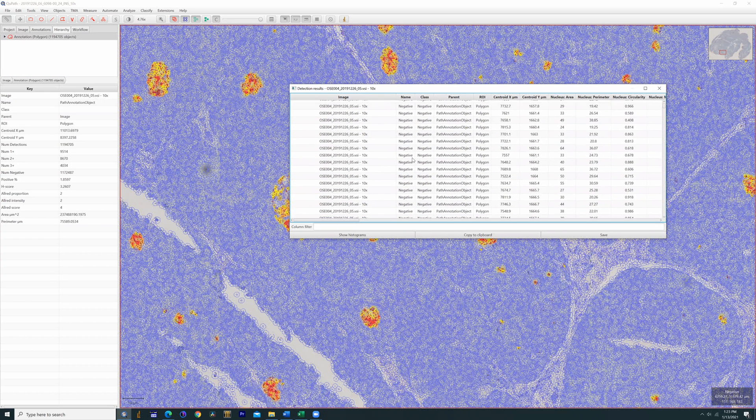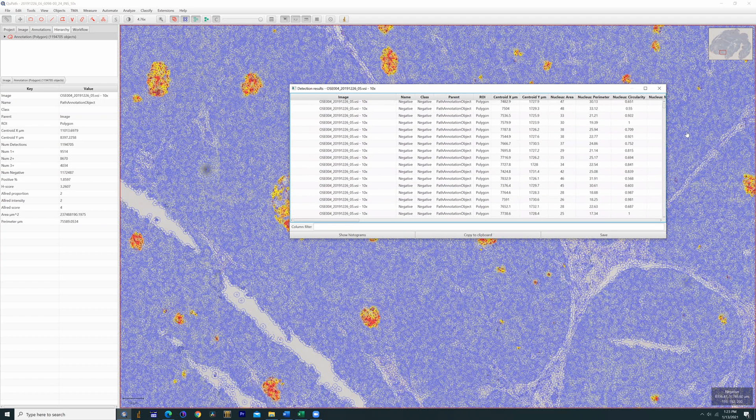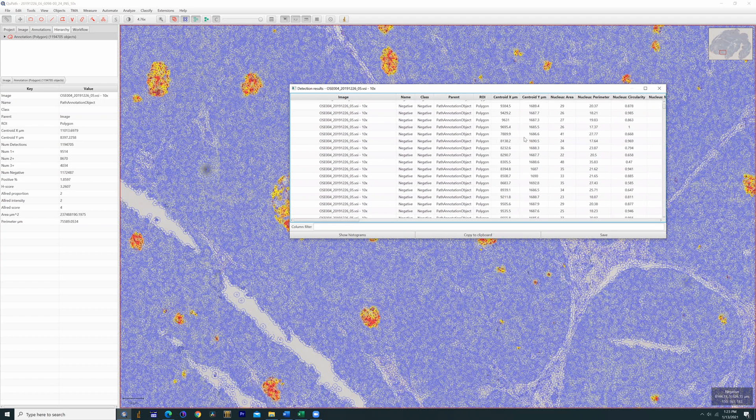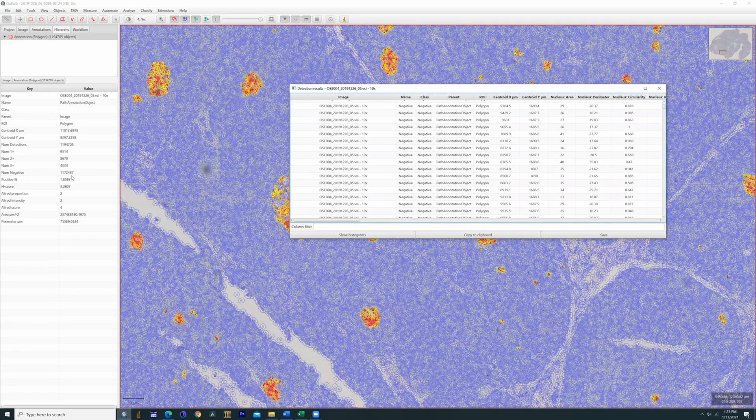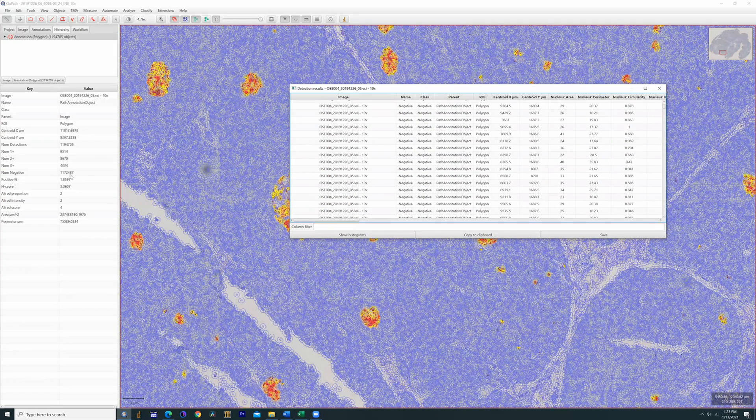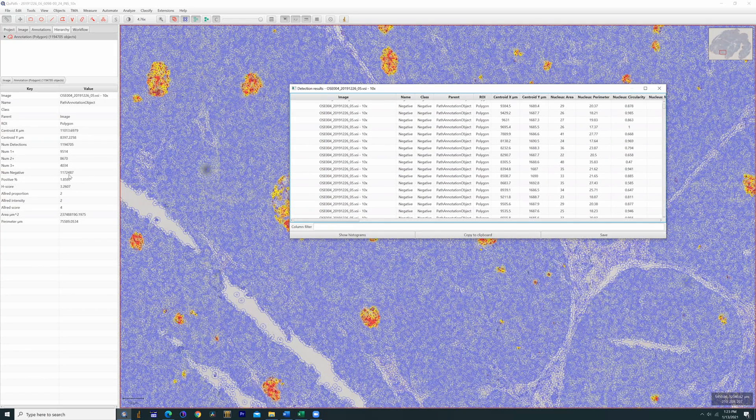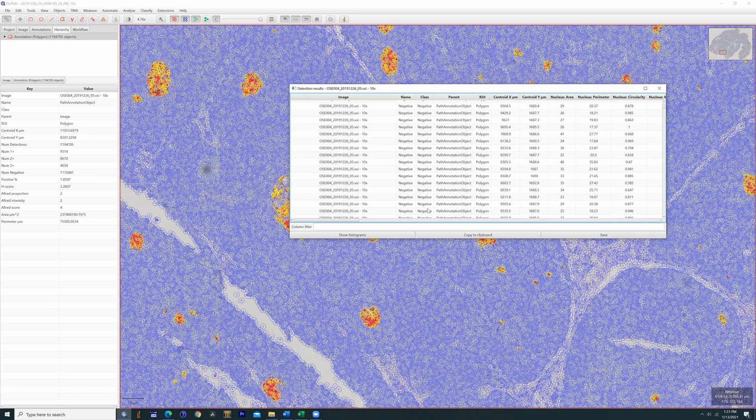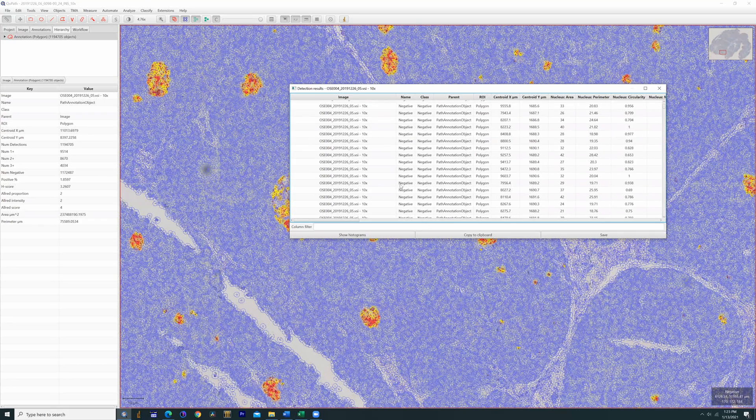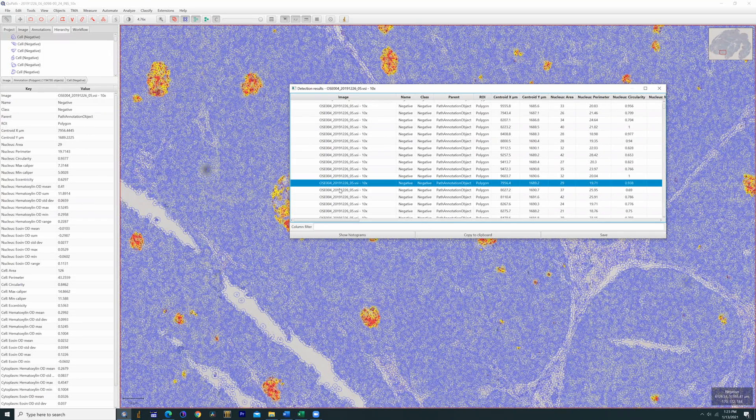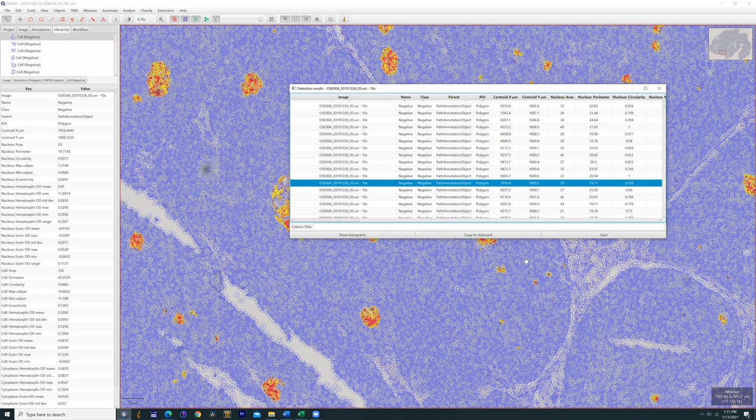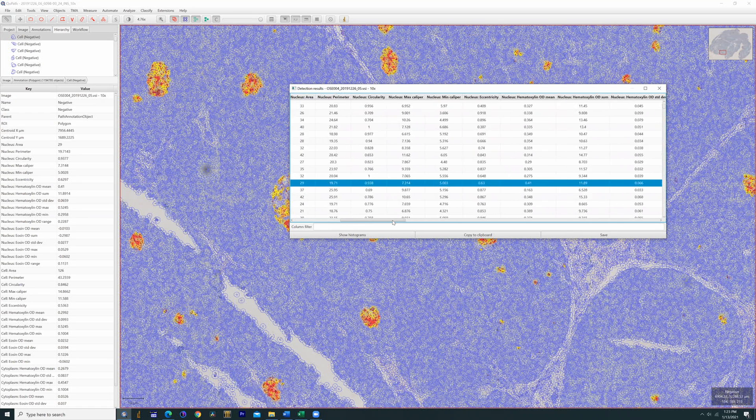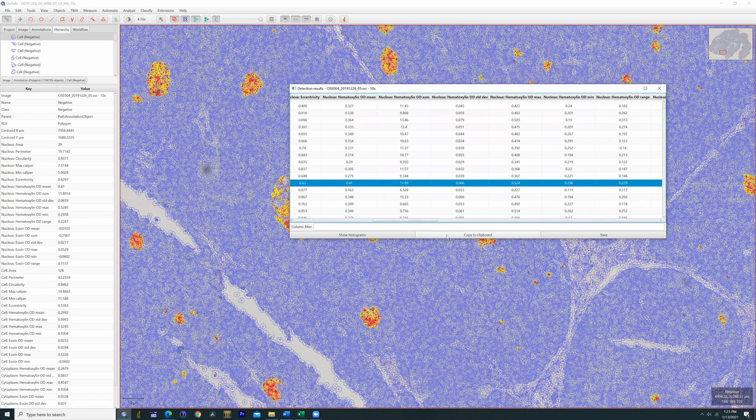The next option, you can actually plot the data within the actual section, all the individual points, under show detection measurements, which is going to give you a full list of all the measurements made. And if you click on them, either there or in here on the individual images, you can actually try to find each of the cells as they're labeled. Obviously most of these are negative. You're talking about a little over a million, 1.2 million cells. But if you click on them, it'll actually highlight the band inside the image, although in this case it may be hard to find given the number of cells. But you get the basic idea: positive, negative, surface area, parameter, everything you might ever want to know.